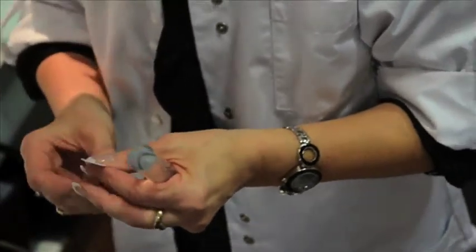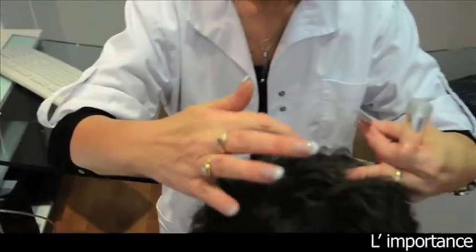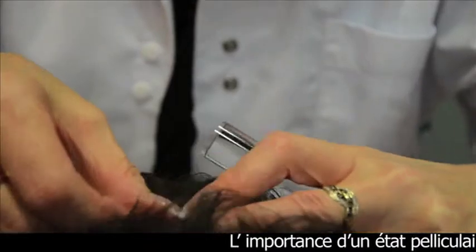Next, we use the same principles to do a desquamation test. So this is to say to see what the pellicular situation is of the scalp, and in the same fashion we will be able to check it and monitor it after treatment.